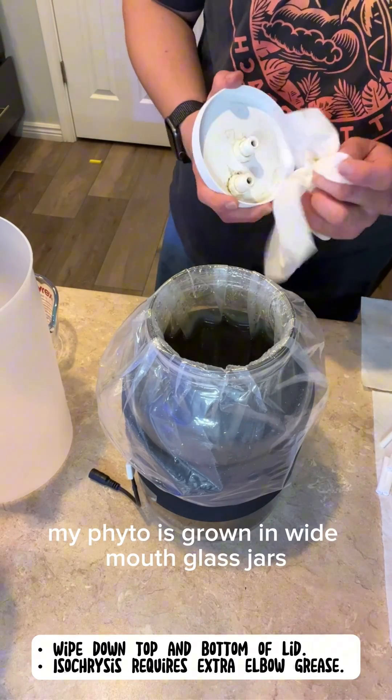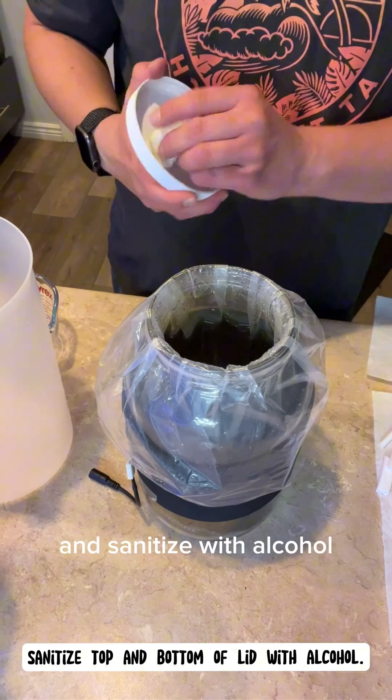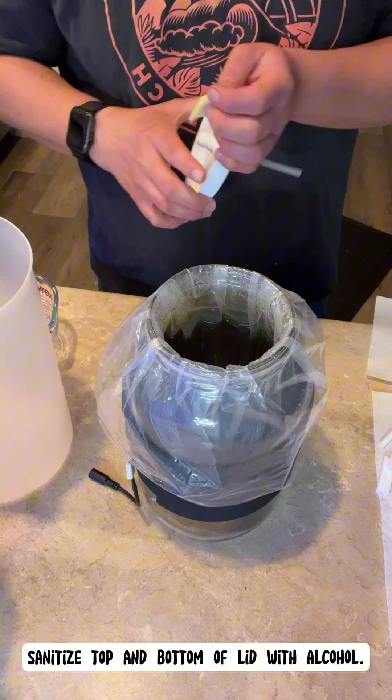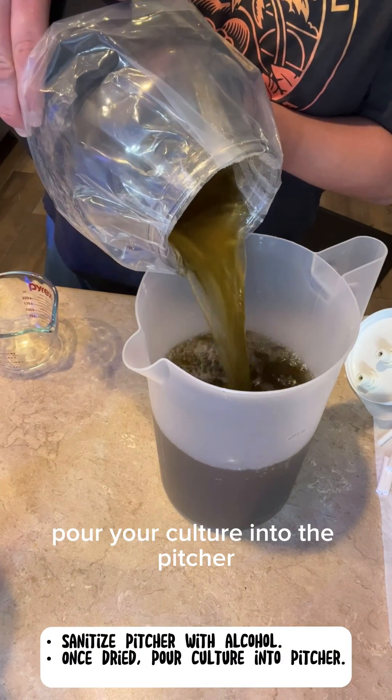My phyto is grown in wide mouth glass jars. Clean the lid with a clean paper towel and sanitize with the alcohol. Sanitize one pitcher with alcohol. Once it's dried, pour your culture into the pitcher.